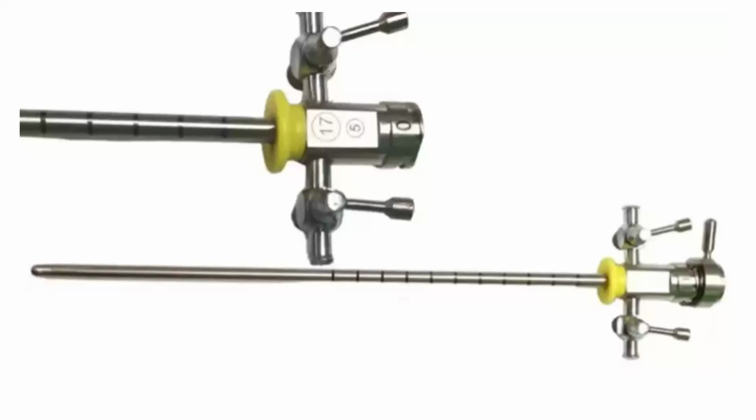Again, it can be used for HoLEP also. Then for URS or PCNL, first you do cystoscopy, put the guide wire, ureteric catheter, dilatation. Yes, sir, we can balloon dilate.